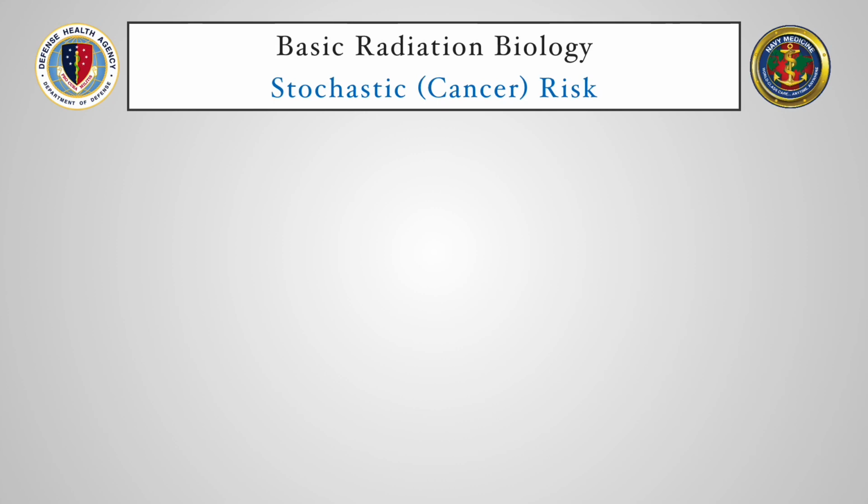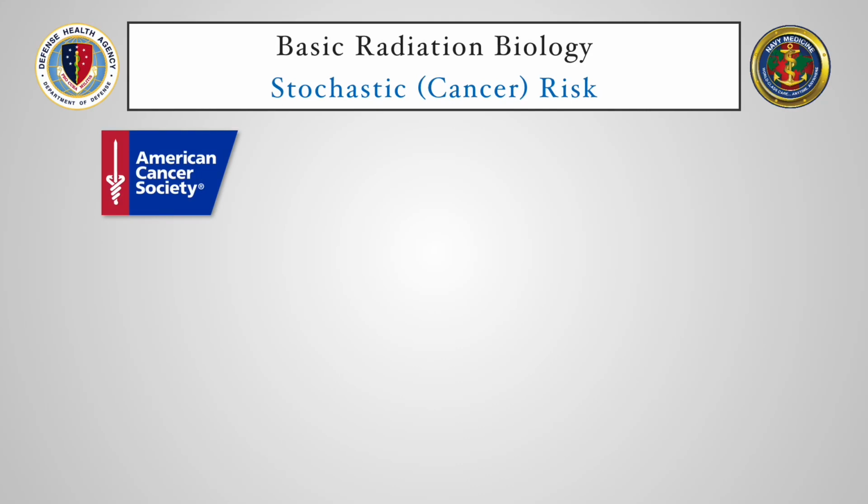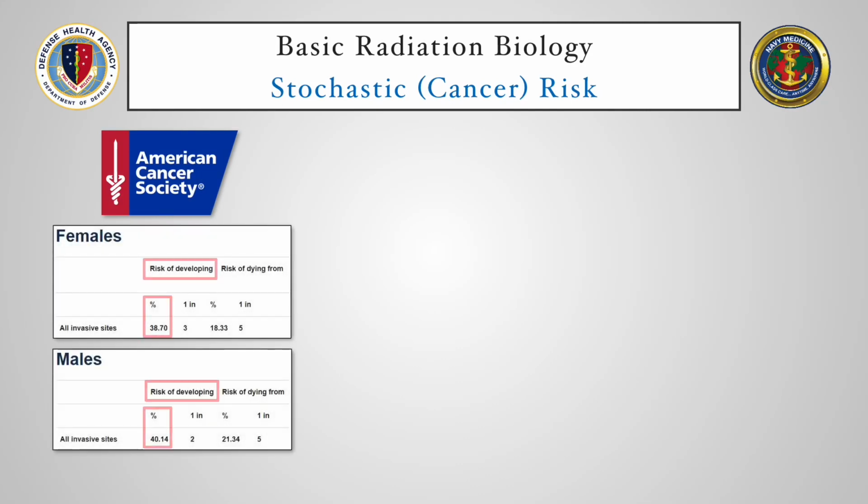Stochastic effects are regarded as the principal health risk from low-dose radiation, including exposures of patient and staff to radiation from diagnostic imaging procedures. Stochastic risk, more briefly put, is cancer risk. So, according to the American Cancer Society, approximately 40% of the population will develop cancer, and 1 in 5 people will die from cancer during their lifetime.